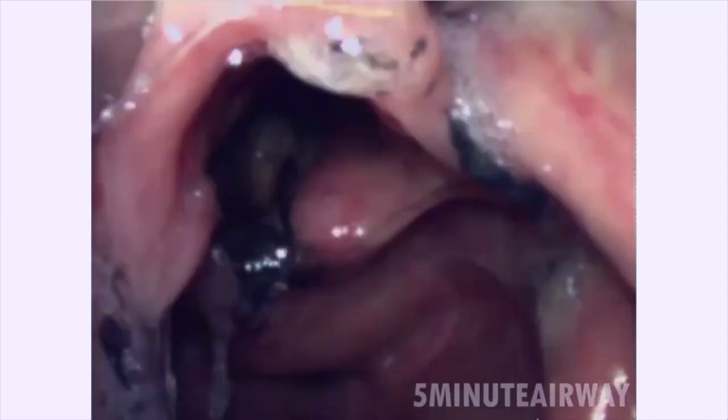Go ahead. Yeah, so the problem that I'm seeing is he didn't really open up the mouth enough, so he had to displace the tongue. But then as he's going down into the actual oropharynx, getting down to the epiglottis, which you see there on the left, my left, and at least your left on the screen probably too, he or she is off axis.